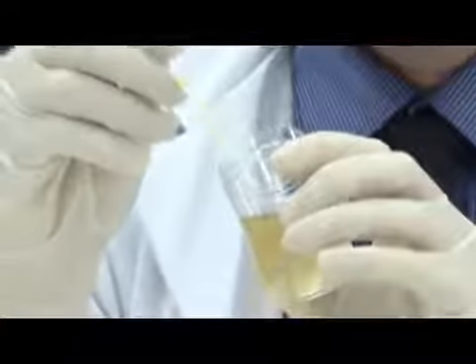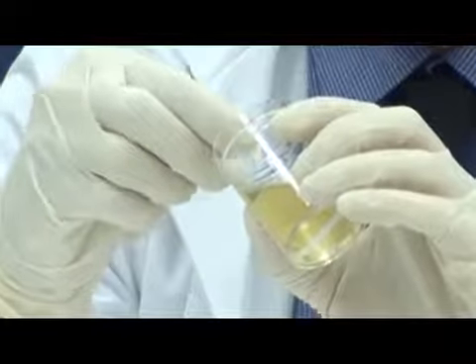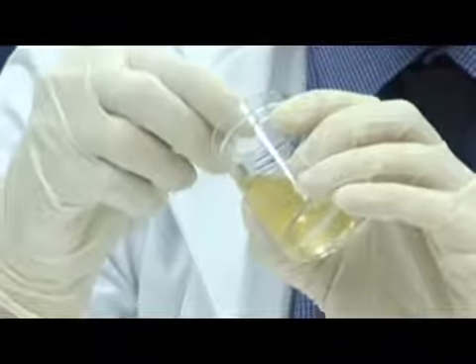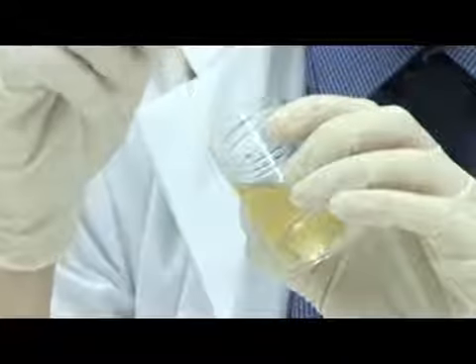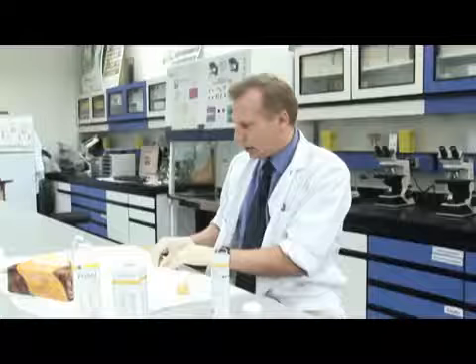So basically we have a urine sample here. We insert the strip into the urine sample, making sure that it's thoroughly immersed and that all the squares are wet so that the chemical will react. Okay, and looks like we're already getting a chemical reaction. First I'll blot off the excess urine on the strip onto the paper, and at most it should take about a minute.